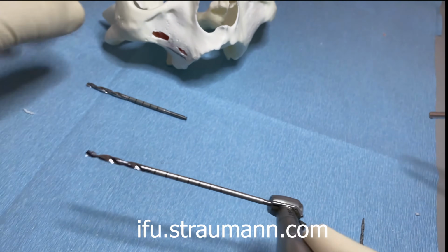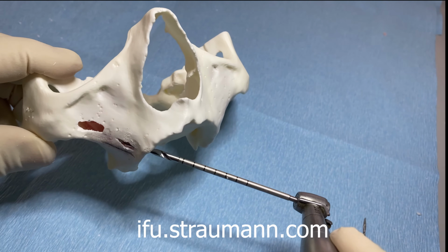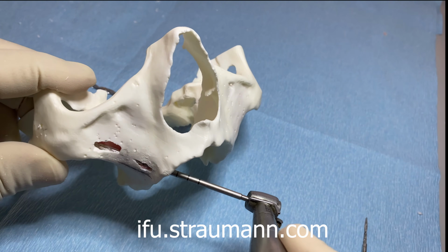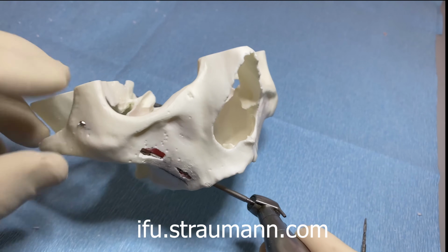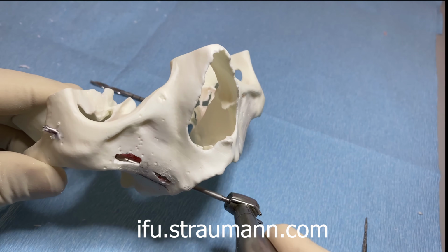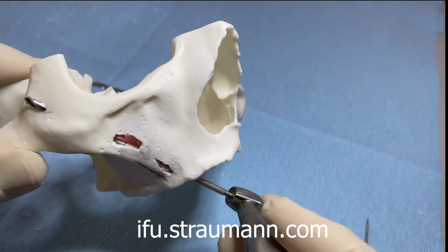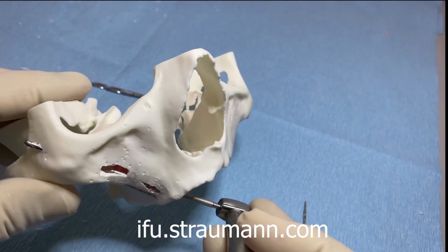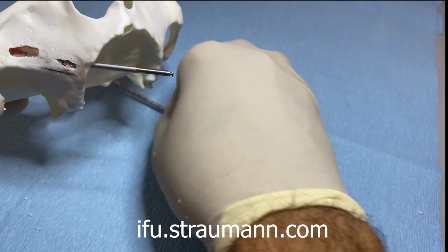So I got a longer drill, and if I was to re-enter the same osteotomy, as you can see, re-entering the same osteotomy, making sure I keep the same trajectory, I can now exit, and you can see I have a lot of room, right? So the point being, we don't need to go past this much, but the more resorption we have, the more likely we need to use the longer burr as opposed to the shorter one.